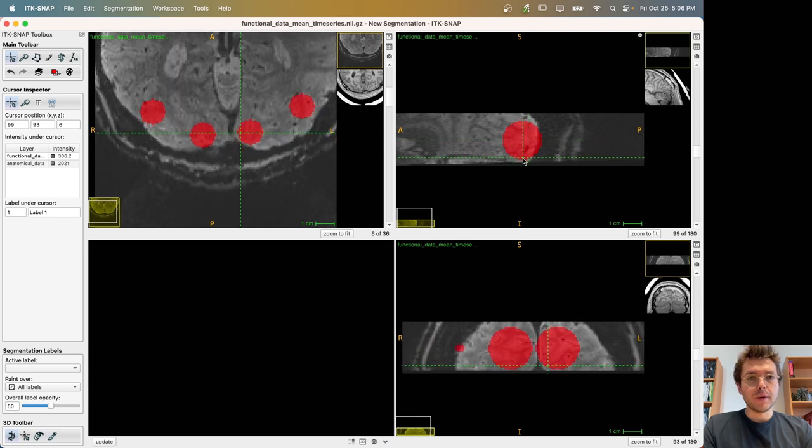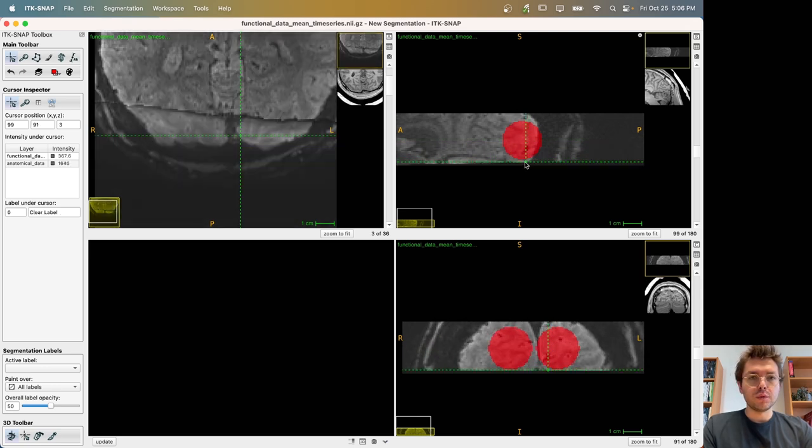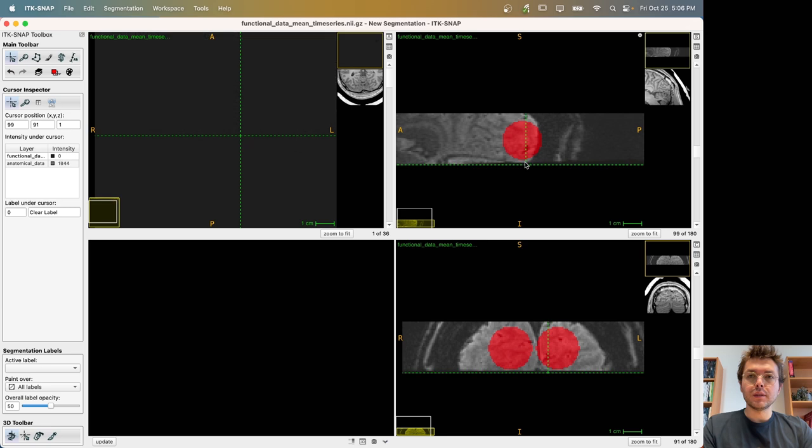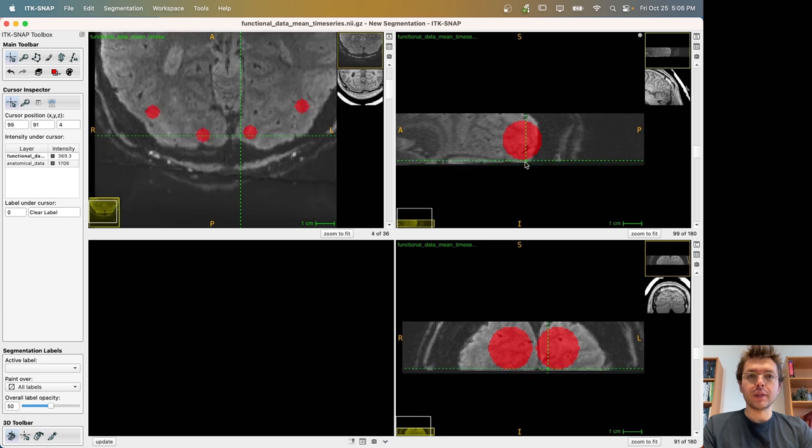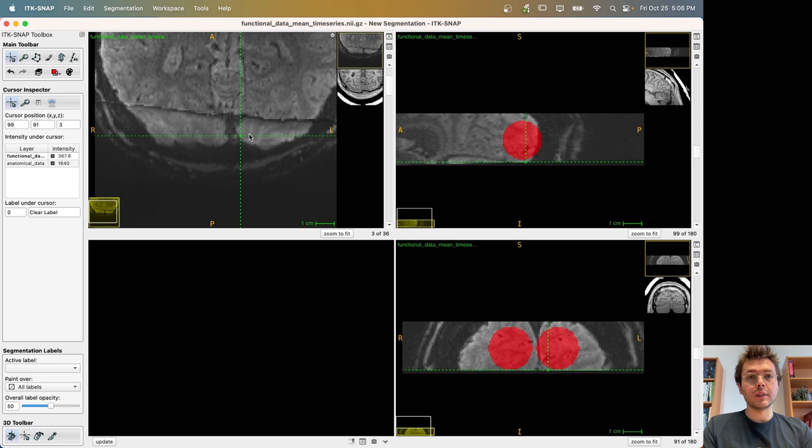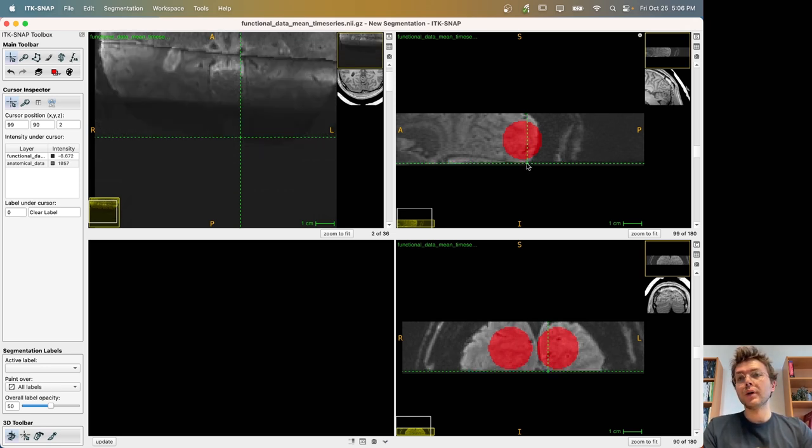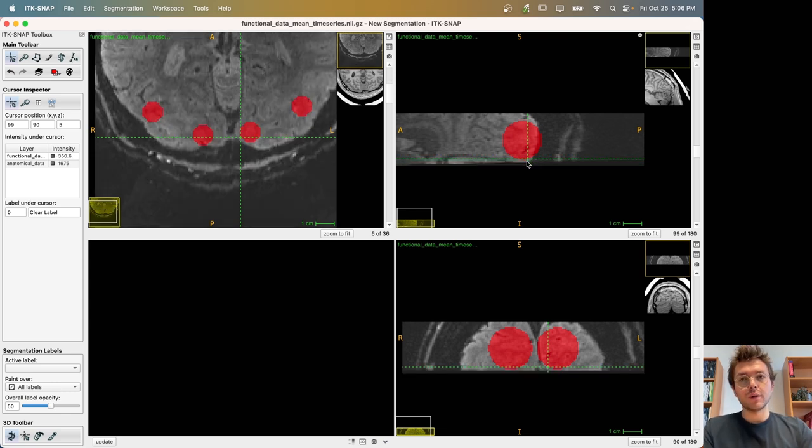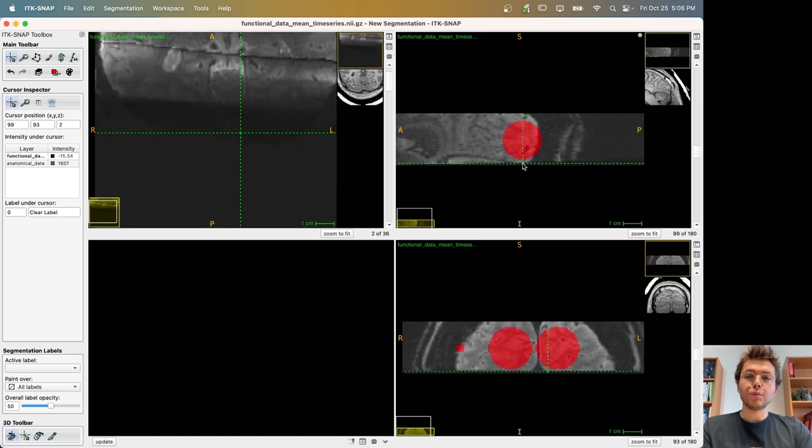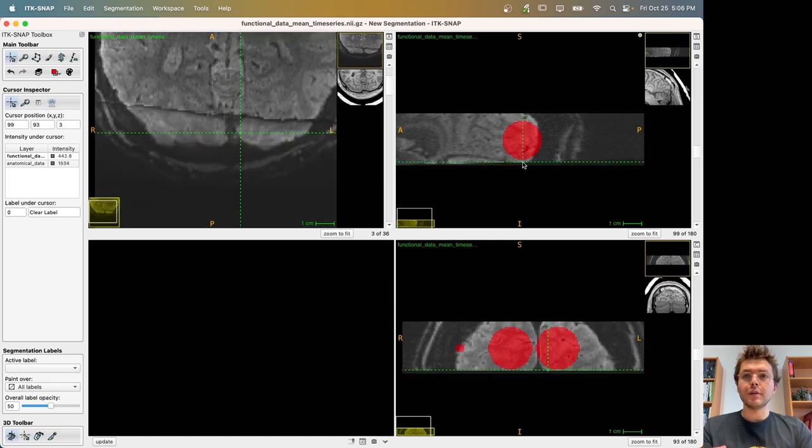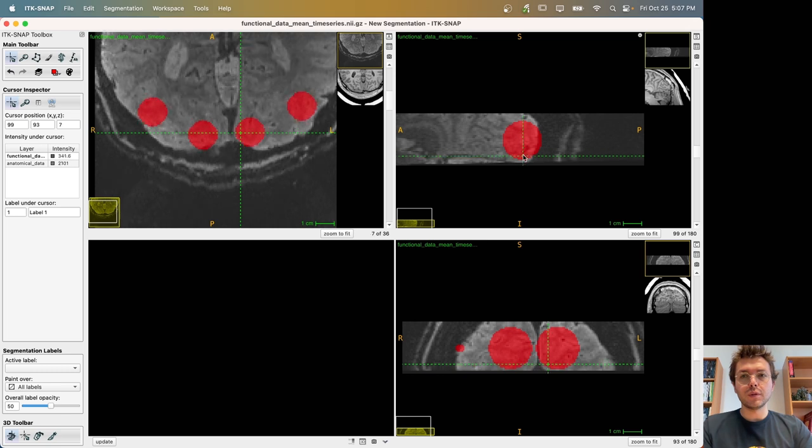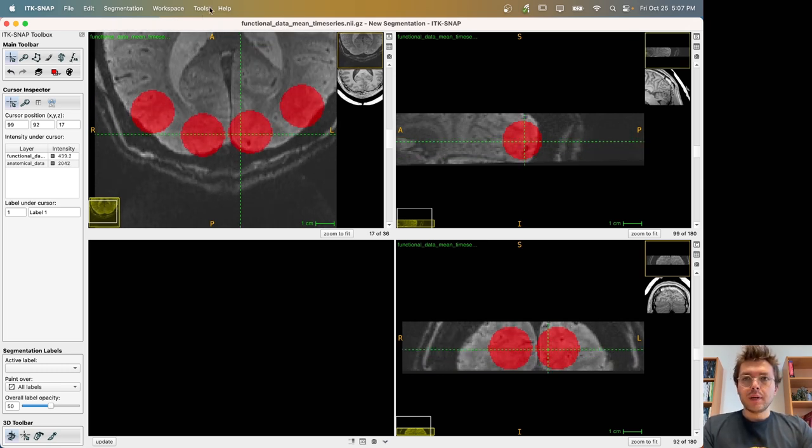Once this is labeled, we can proceed. However, there is one detail that I would like to mention. You can see that some of the inferior slices of this fMRI dataset is dark or has some residual artifacts from the way this data is pre-processed and motion correction is done. Usually, these slices are good to avoid in this registration mask drawing process. I'm just saying this because if this sphere was including these later slices, it would have been better if we removed them. But now, they are not included, so we don't need to do more about it.